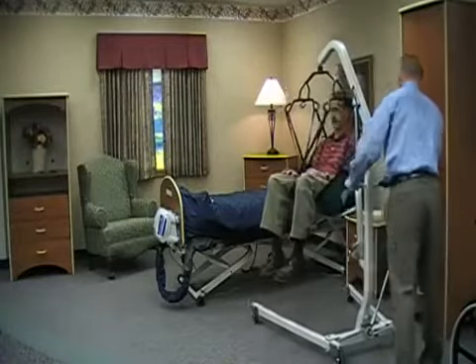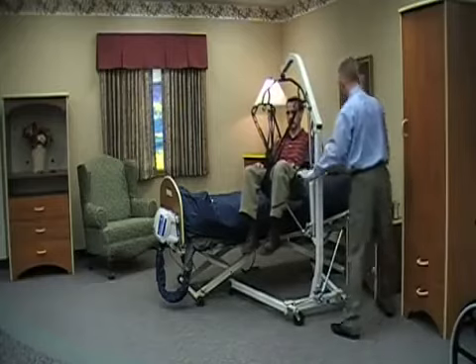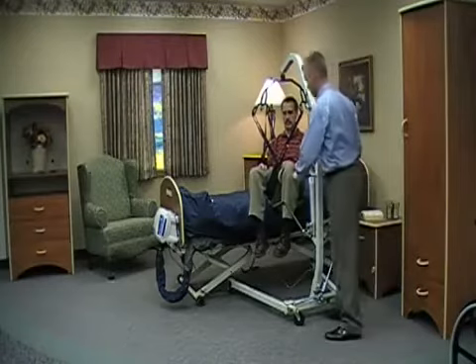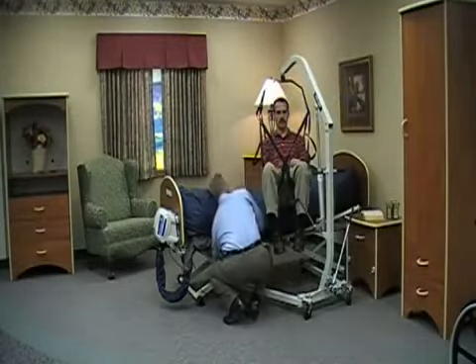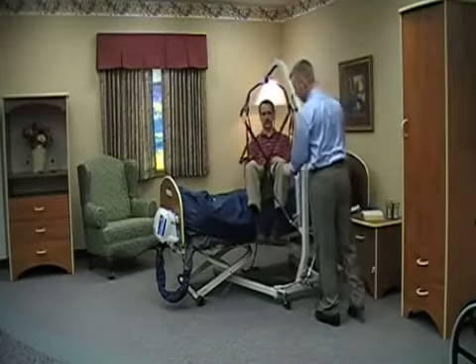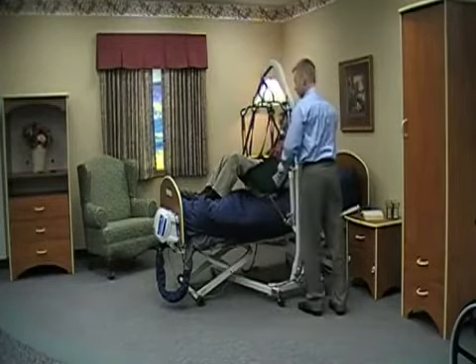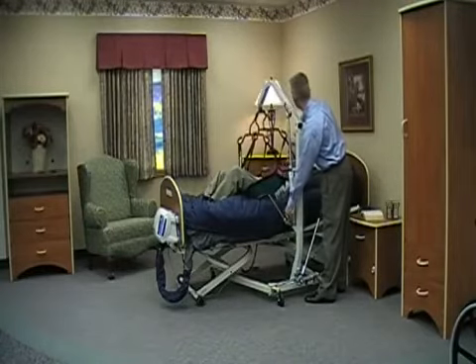I've kept the legs of the base open to allow for a safer transfer. We want to ensure that we clear any wires or anything that might be underneath the bed surface. We can go ahead and position them appropriately. After having ensured that our resident is in the appropriate place, we can go ahead and turn that dial and lower them.